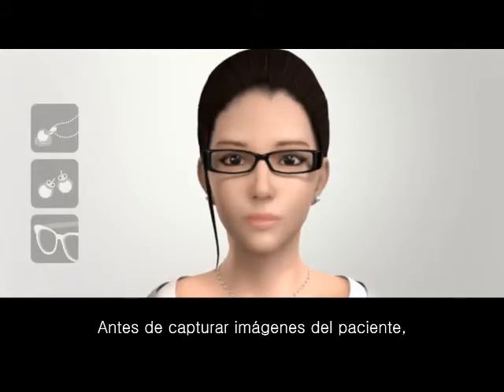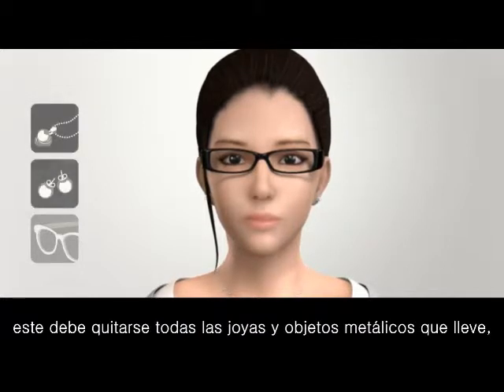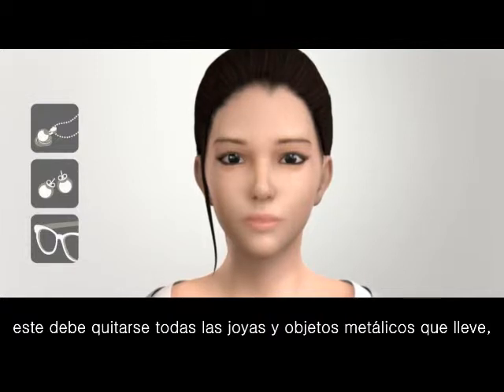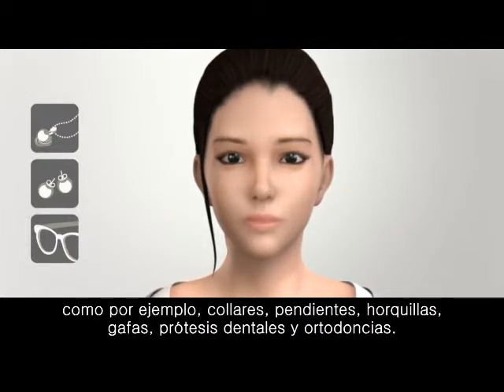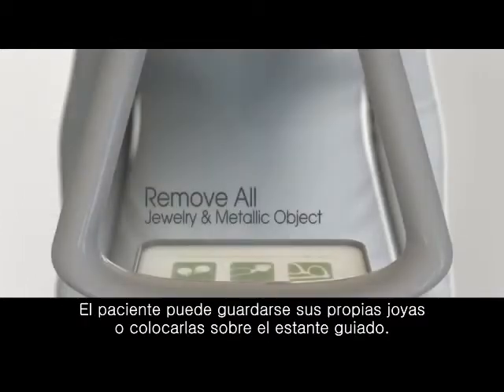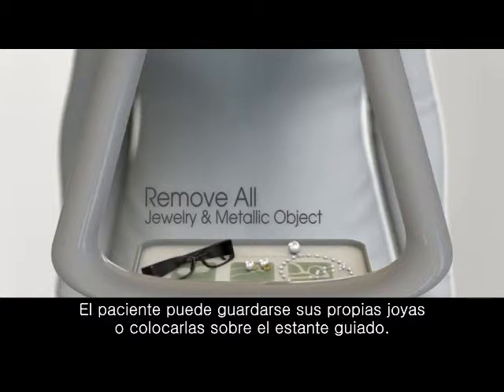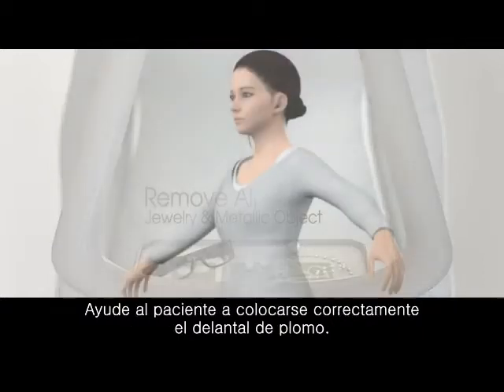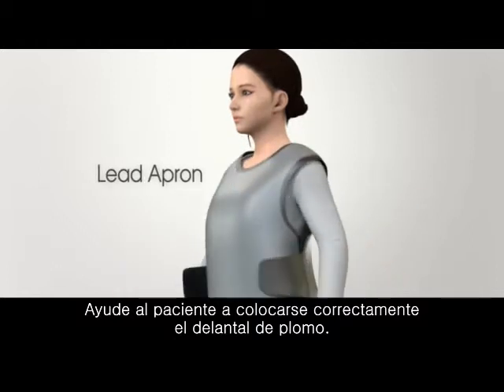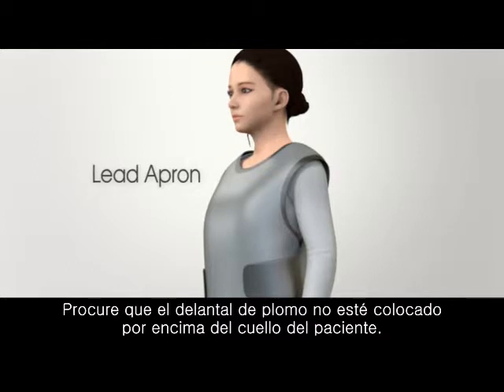Guide the patient to the unit. All jewelry and metallic objects such as necklaces, earrings, hairpins, eyeglasses, dentures, and orthodontic appliances should be removed before image capturing. The patient can keep their removed jewelry personally or place them on the guided shelf. Assist the patient to appropriately wear the lead apron, being careful that the lead apron is not above the patient's neck.